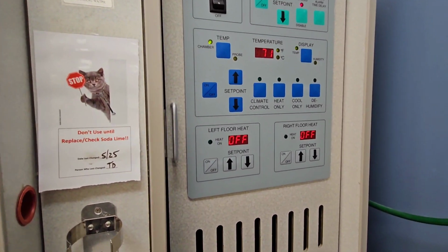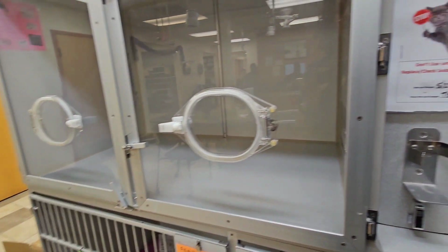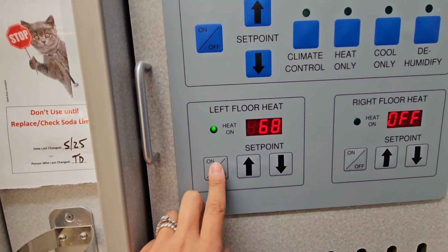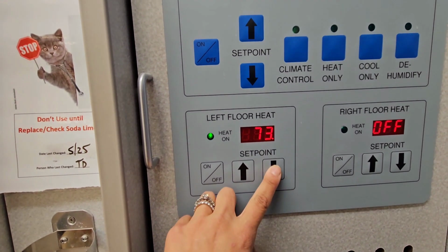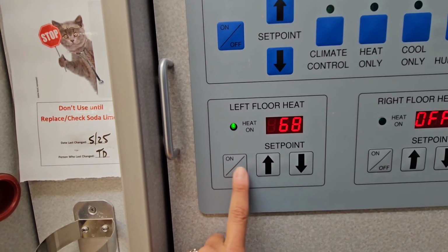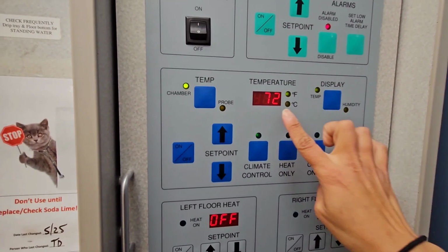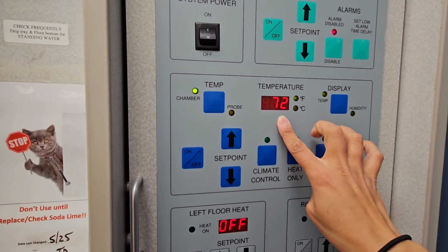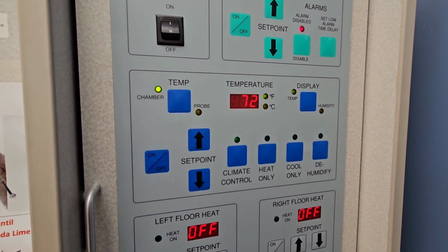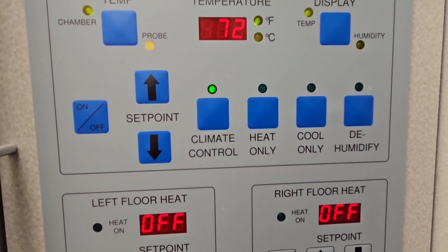Some other settings here, you can change the temperature of the floor in the cage. Just be careful to always be checking it to make sure it's not too hot. You can change it by turning it on here and changing the temperature just like you do up here. The set points will be 2% or 2 degrees apart on the high and the low, but I'm going to keep that off. I'm going to keep this one off too. This is the temperature of the whole unit. We just want to make sure that that is roughly around 72. If it gets too warm in there, we want to adjust that. Climate control should be generally what we keep it at.